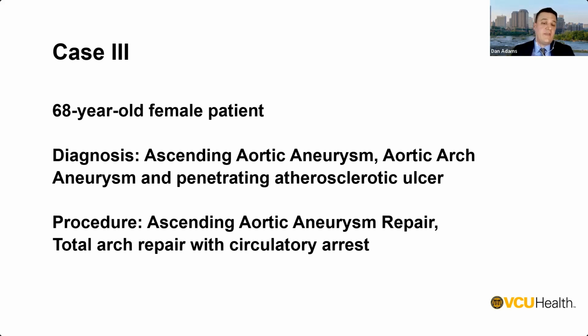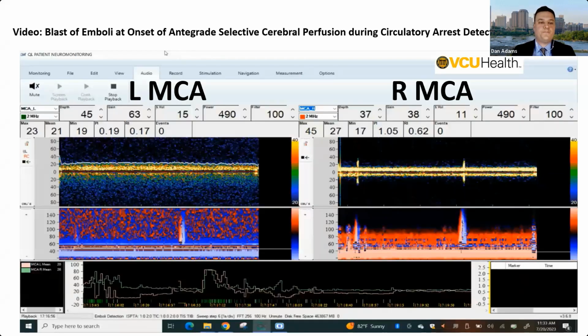We did not present the embolic alert at that time because it was not in the scope of the presentation to guide adequate selective cerebral perfusion. This year, we will present the appearance of air emboli detected through the use of intraoperative TCD. I will now present another blast of air emboli captured on our intraoperative TCD on the DWL system while insonating the bilateral middle cerebral arteries.